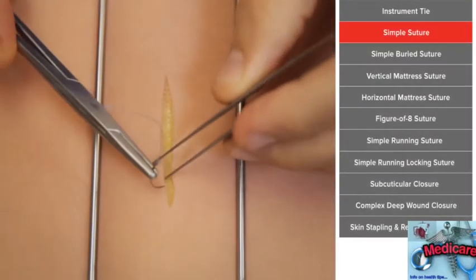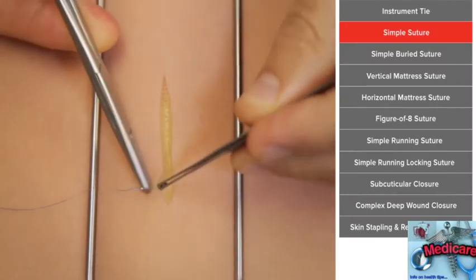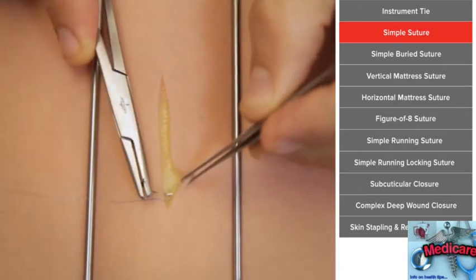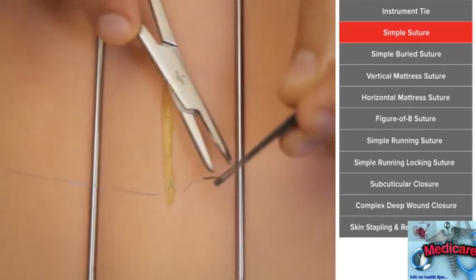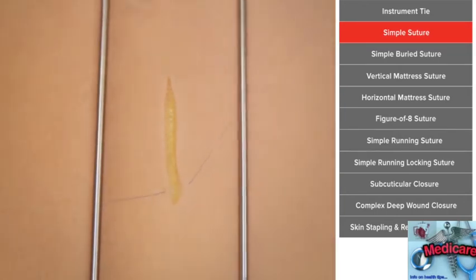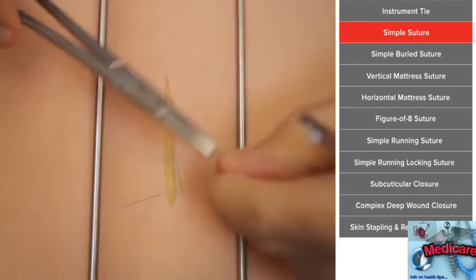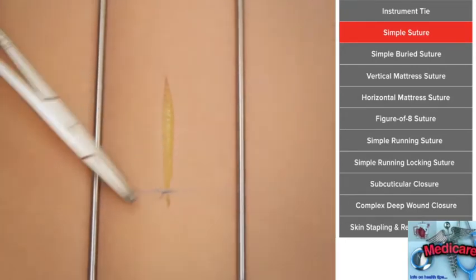So the first suture I want to teach you is a simple suture. Simple because there's really only one part to it. You're simply going to put the needle in on one side and then put it through on the other side. So it's important to hold the needle in the middle, enter at 90 degrees, exit, and then try to enter again so you can come into the tissue and come up at 90 degrees. Having it 90 degrees on both sides, when you tie it, will approximate the skin beautifully.